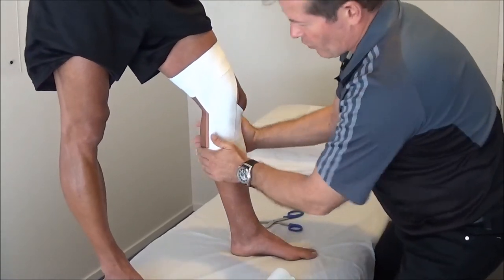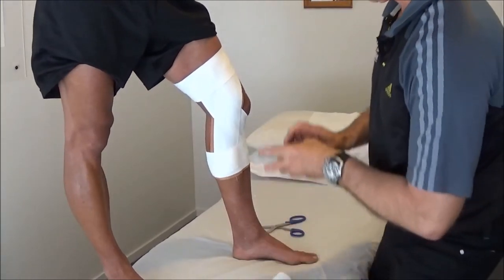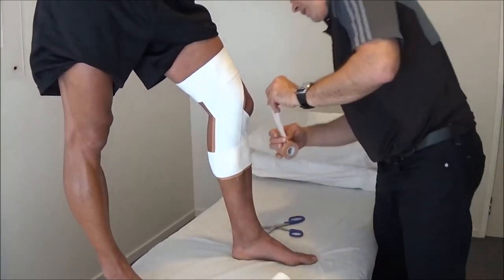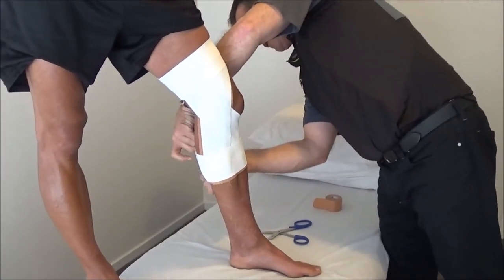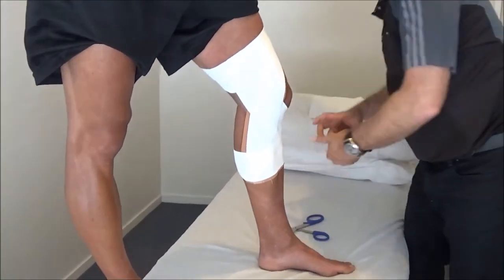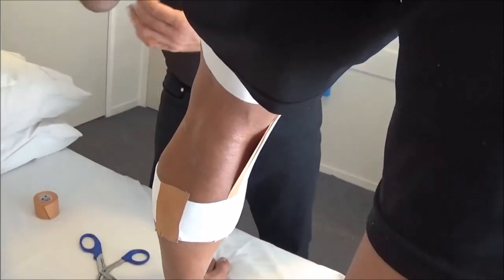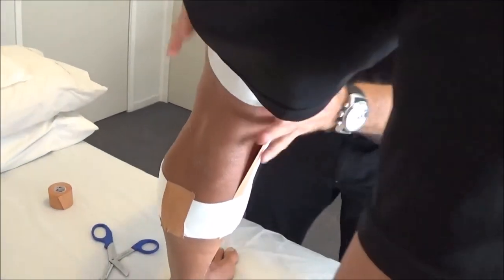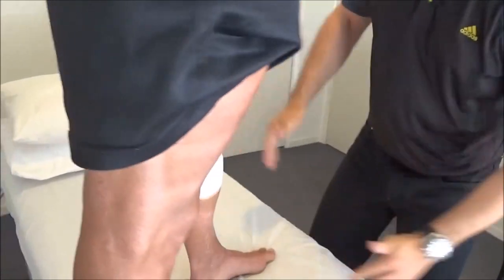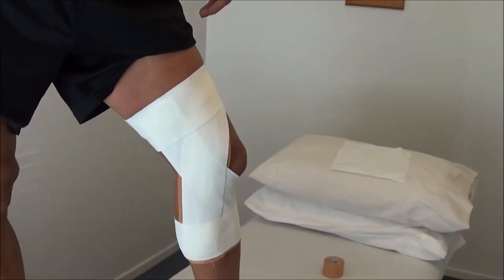Now if you wanted more cover, you can actually repeat that again, and then once you've finished that, you get your brown tape again and just put a little bit to stick the white stuff down where the join is. And that's it, if you're ready for action. Nice and neat and pretty easy to do. Done.